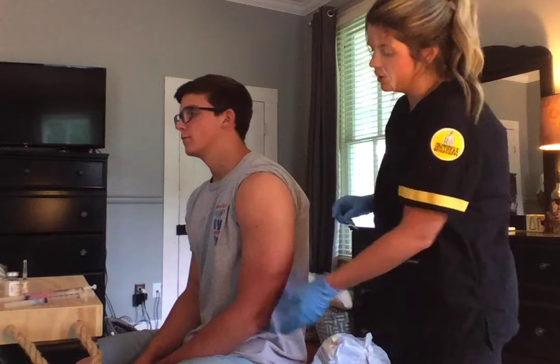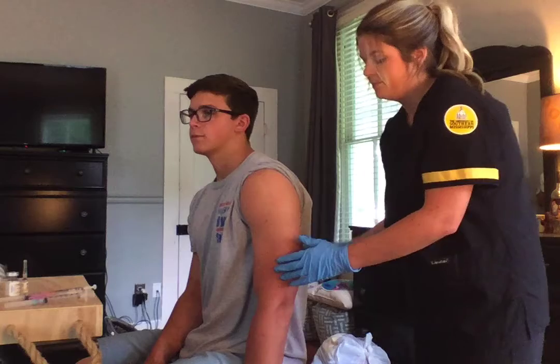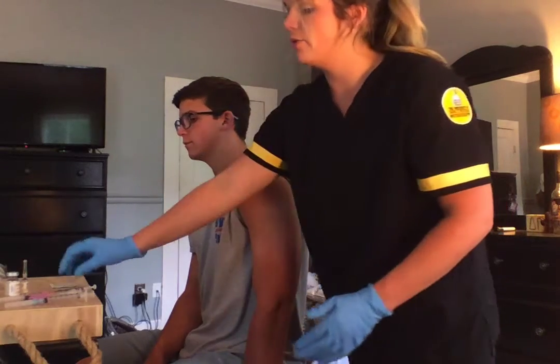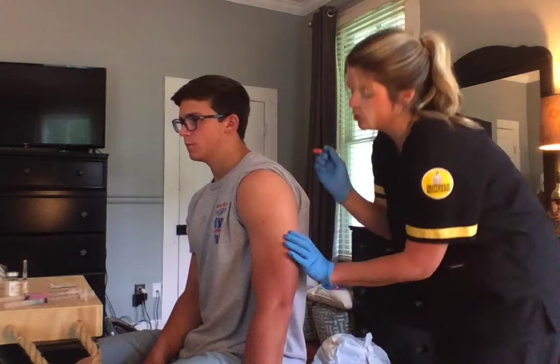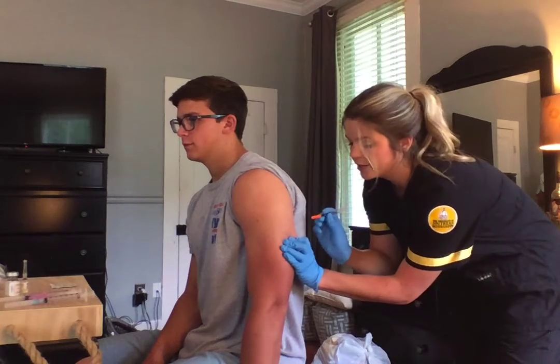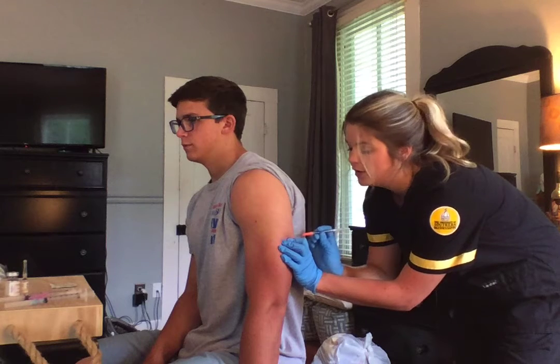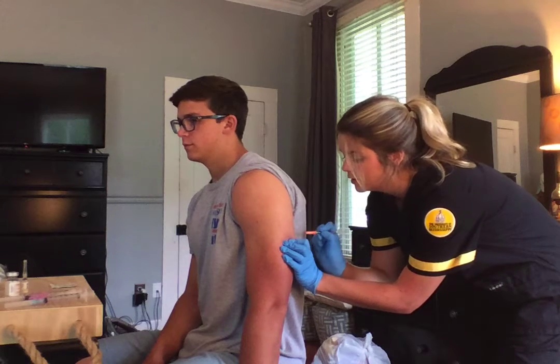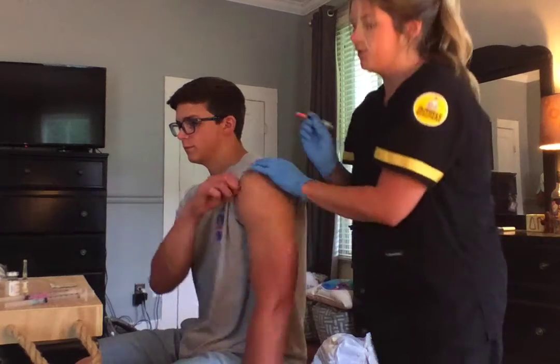I'm going to get you to relax your arm for me and just let it hang. That's perfect. So now I will take my syringe and I will carefully remove the cap. I will pinch 2 inches of skin, and since I can pinch a full 2 inches of skin, I'm going to put it in at a 90-degree angle. I'm going to put it in on 3, 1, 2, 3. It's in, I administer the medicine, and it's out. So you're good to go on that one.